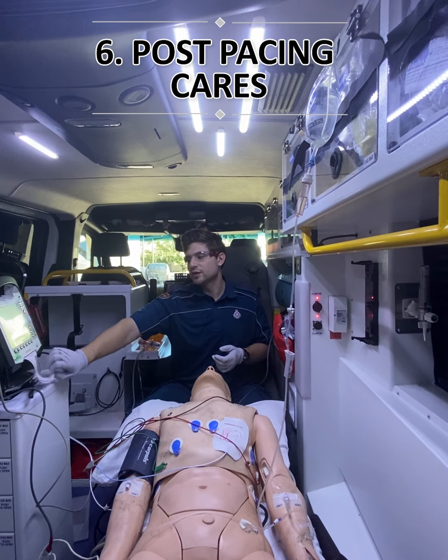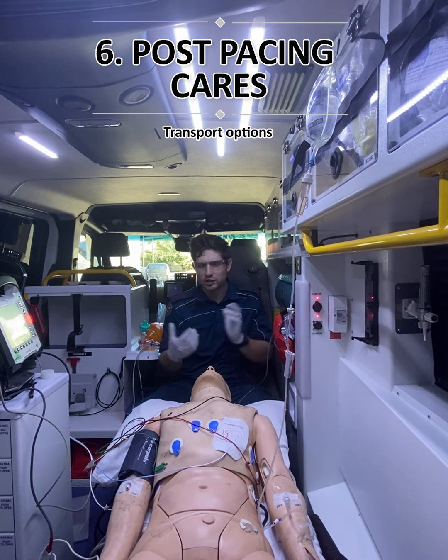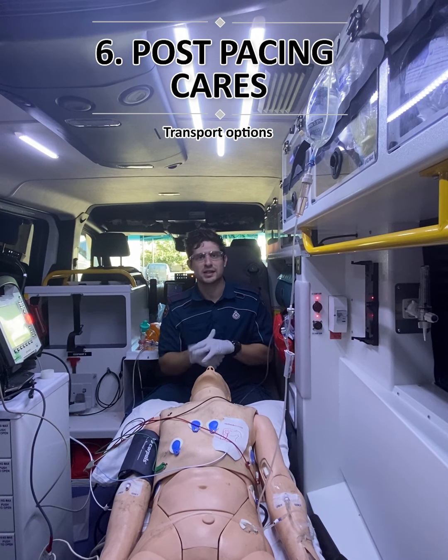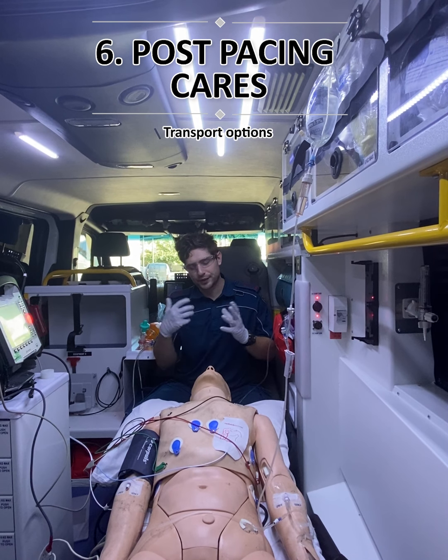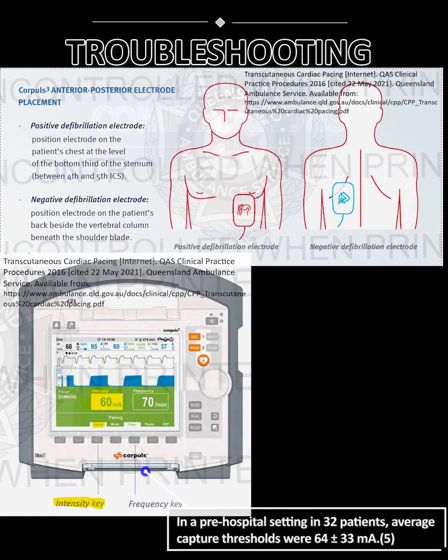As far as treatment options for this patient, we have a patient here who's in a complete heart block. This patient's probably going to need a pacemaker. Going through to a facility with cardiothoracic considerations is probably advisable. Our 2 most common causes of failure is our pad placement or inadequate amplitude in our intensity. So adjusting these is key.